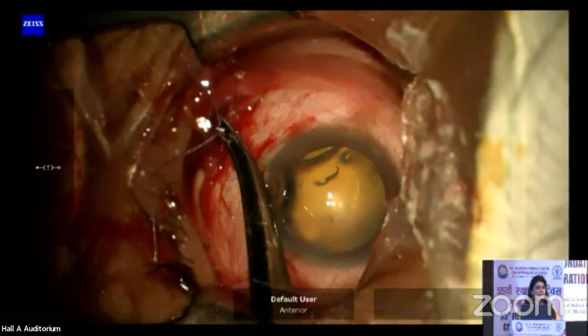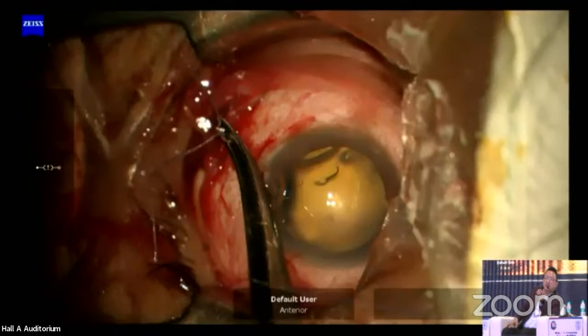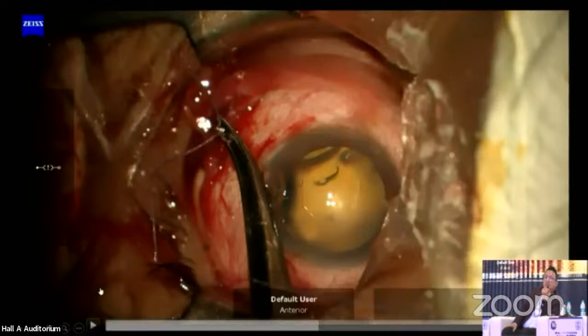One thing, when you're doing this hangback technique, you have to be careful. You have to leave an extra length that can be pulled out during the removal of the plaque. If it is placed very short, then while removing the plaque, there can be entangling and difficulty in removing the active plaque. That's one important thing. And while removing, you also have to be careful, because if you mistakenly cut the anterior part, then you will have difficulty searching for the remnant of the lateral rectus muscle.